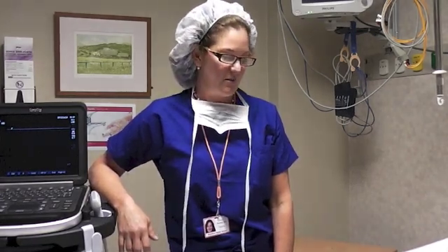I am Dr. Teresa Bolling. The purpose of this video is to demonstrate a supraclavicular block or catheter. The most important thing we do to start is to position the patient, which can be critical when we're trying to achieve a successful block.